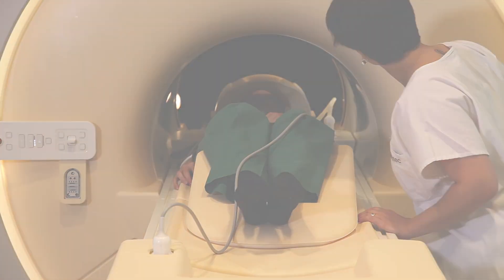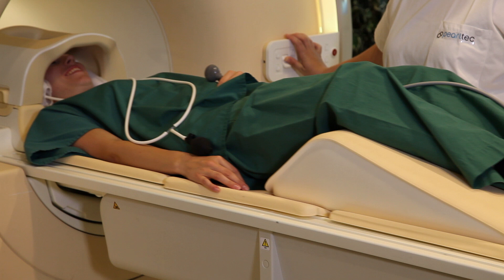The PearlTech technology is designed to increase workflow efficiency and to reduce the amount of patient movement, leading to better image quality.